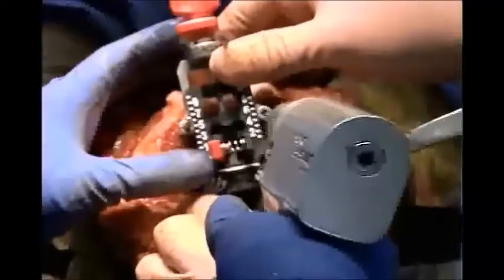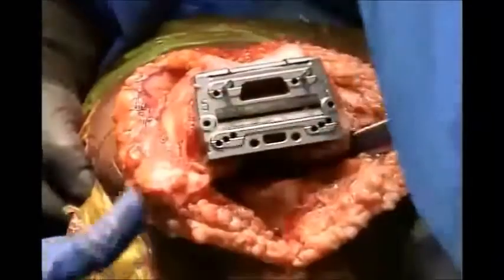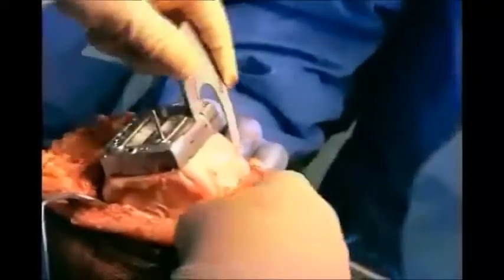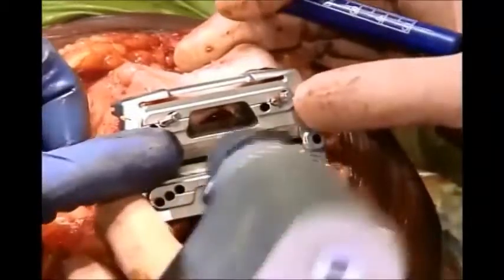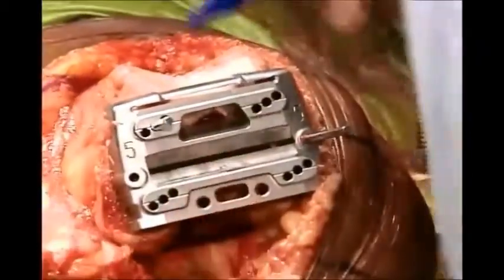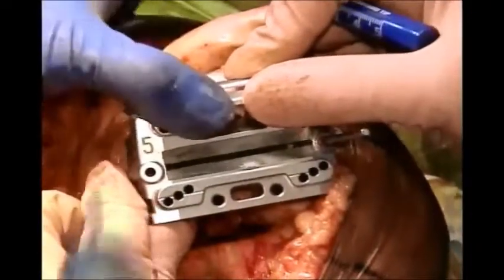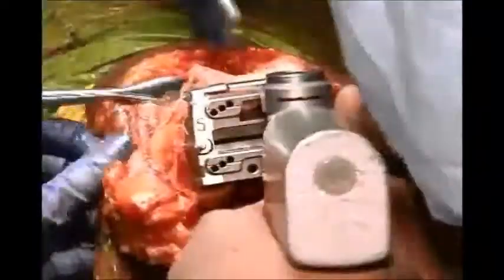Apply the femoral sizer and size the femur correctly. Whatever size you assess, put that block in and make sure you are not going to notch it — the gap should be equal to 18 to 20 millimeters. For the posterior condylar cut, I do it parallel to the tibial cut, adjusting a few millimeters either medially, laterally, or both sides. The gap should be 18 to 20 millimeters, then you test it with the block.